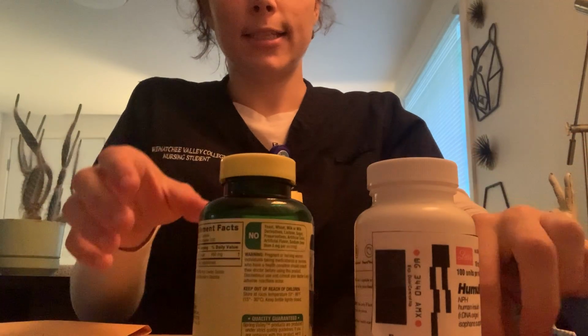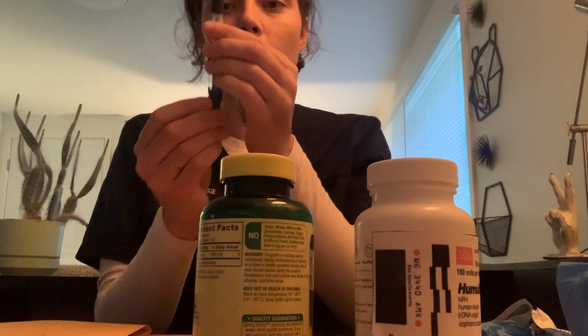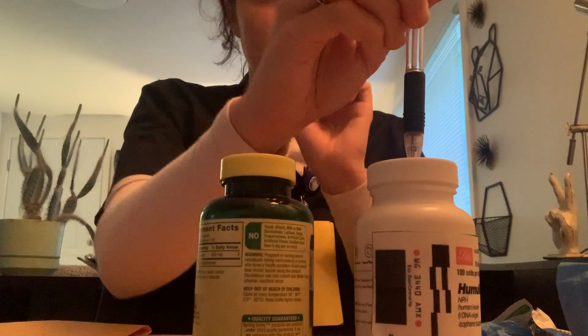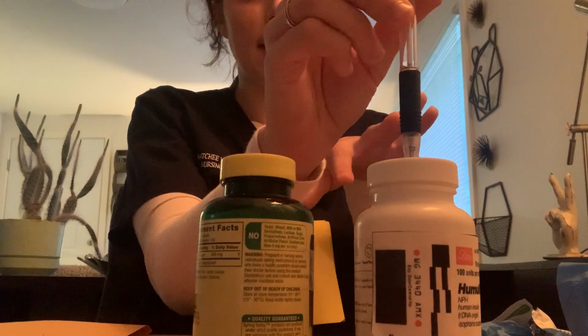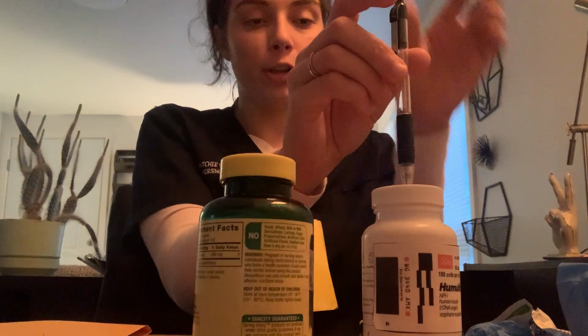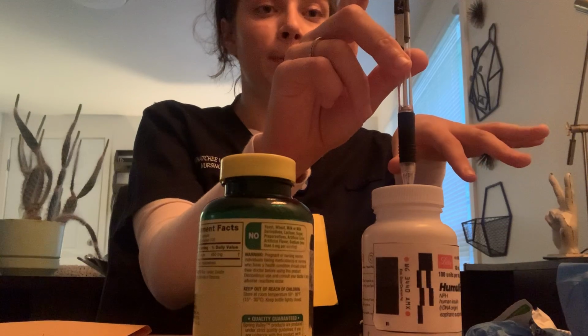We are going to take our insulin syringe. I've created my own insulin syringe prop. They're typically orange and they come in units. We only use an insulin syringe for insulin administration. Take off the top and draw back 12 units of air. Inject in, ensuring that the end of the needle is not going into the insulin NPH, as this can cause cross-contamination and we'll need to restart over again. Inject the air.